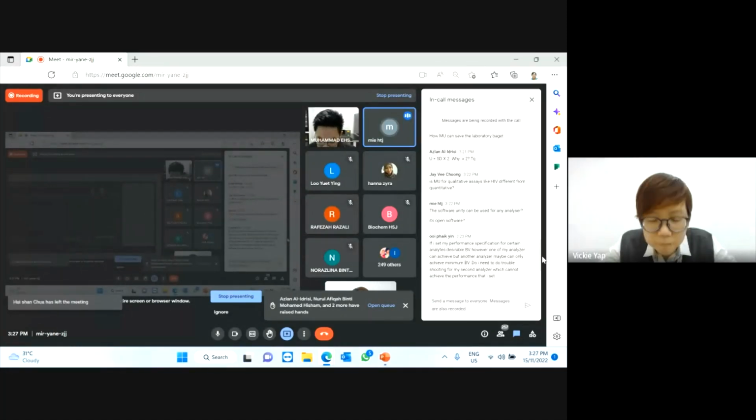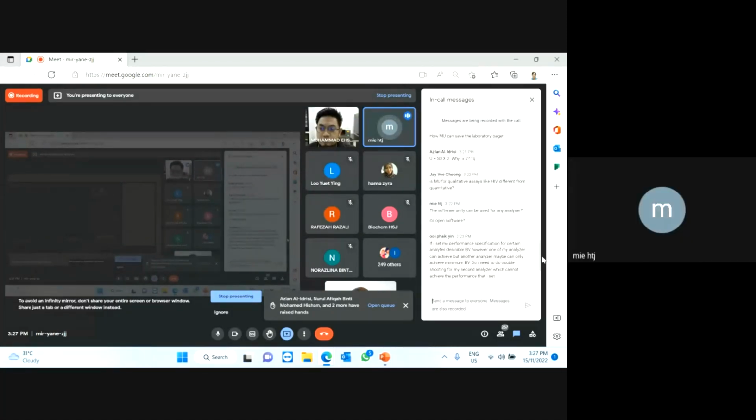Either it's positive or negative based on the detection limit. Now my question is, if any assay kit that we bought from a company already mentions in the product insert a borderline or gray zone, should we calculate the MU also?